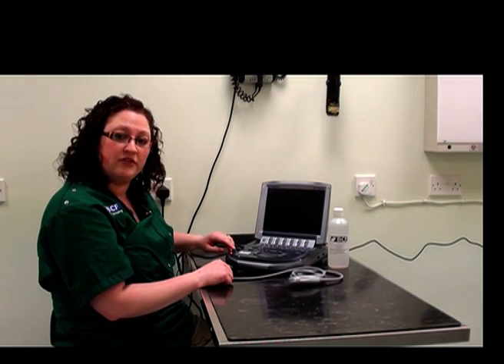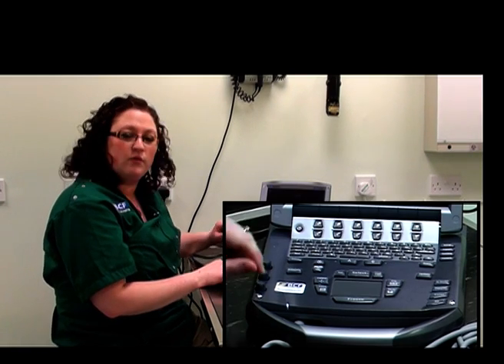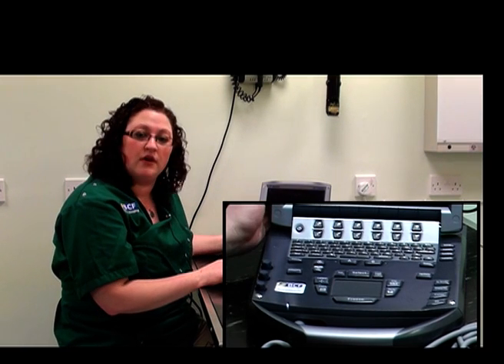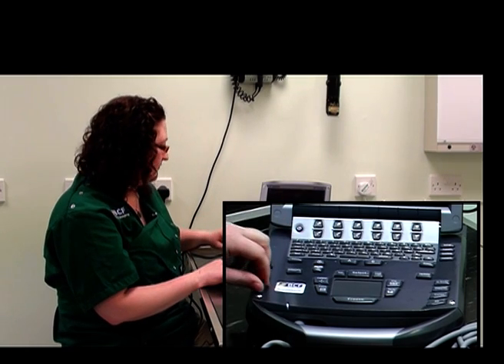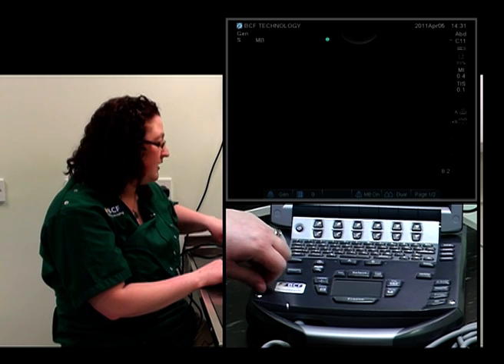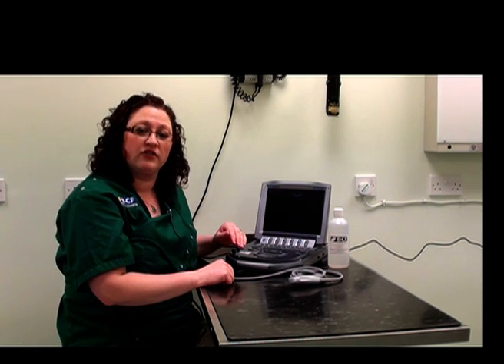It's also important to know where the overall gain button is. On this machine, it's located as a pop-up button. What the overall gain button does is it increases the overall brightness of the image displayed on the screen, regardless of the depth. It's important to use this button very sparingly, as having the image either too dark or too bright can actually lead to misinterpretation of what's displayed on the screen.